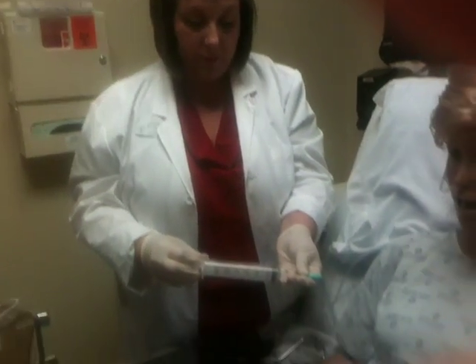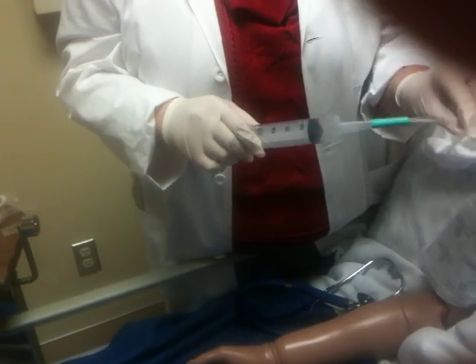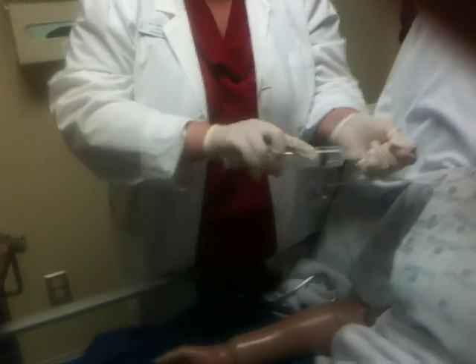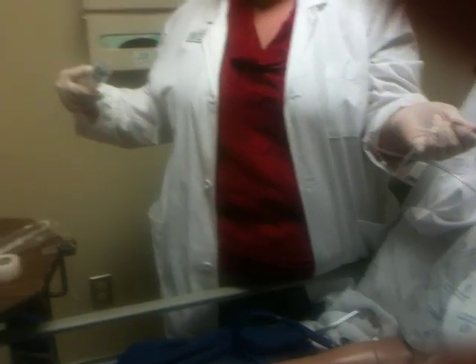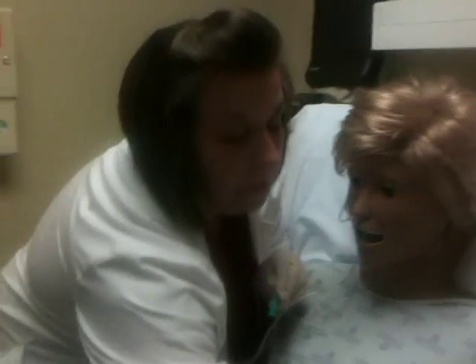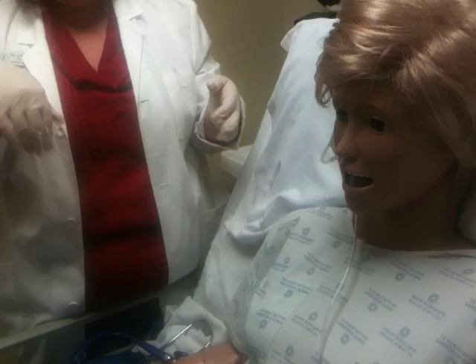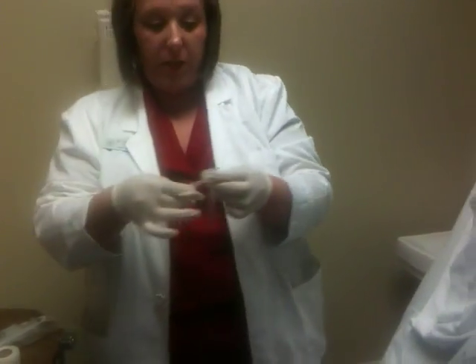Then you would want to aspirate gastric content. And it should be green or a tan color. Go ahead and clamp your tube off so that you're not getting any gastric content on you. If you have pH paper available, you would test the pH of the fluid. Now I would go ahead, and this should have a little adapter, and I would hook this to suction. If it wasn't supposed to be hooked to suction, you would just clamp it off. Okay? Once I've verified placement, then I would secure my tube.